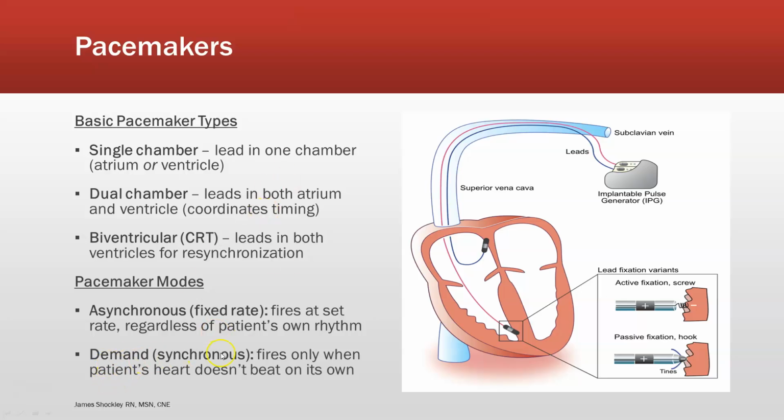Demand is a little different, in that we set it up to look at whether or not your heart has the ability to produce its own electrical signal to convert to a mechanical function. We set it up to give your heart time, maybe just a fraction of a second.